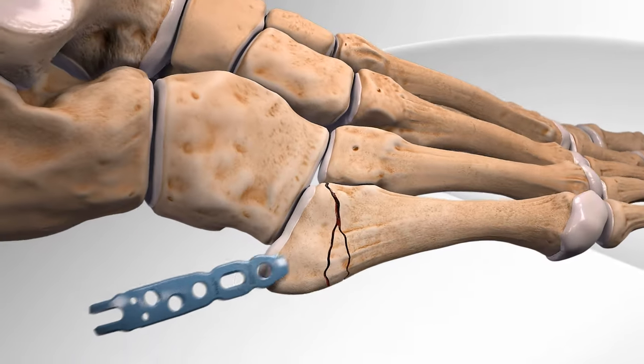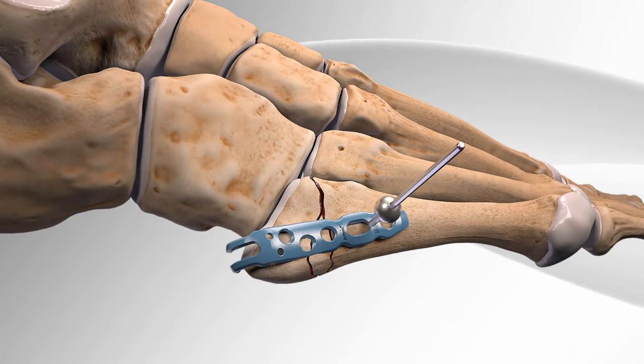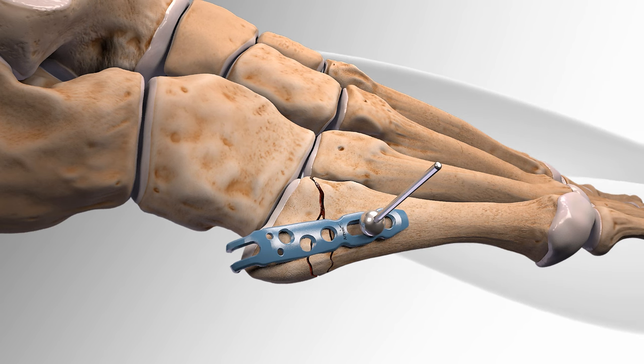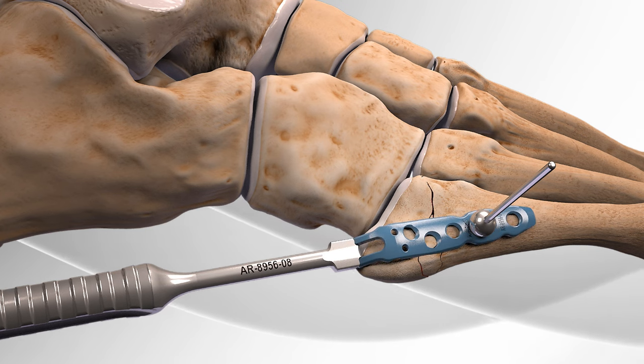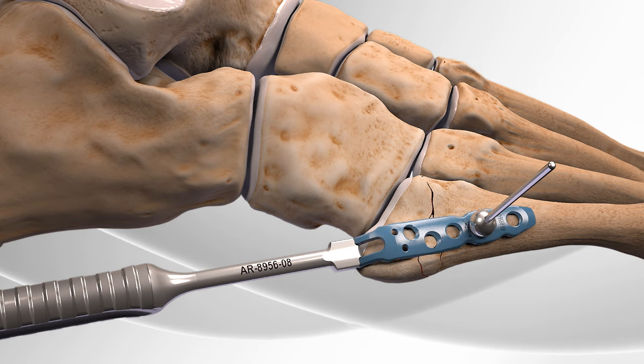First, the surgeon places the hook-shaped plate on the bulge at the base of the fifth metatarsal bone and inserts a tack-like device to hold the plate. The surgeon then uses a tool to push the hook plate closer to the bone so that it tightens the broken bones together.